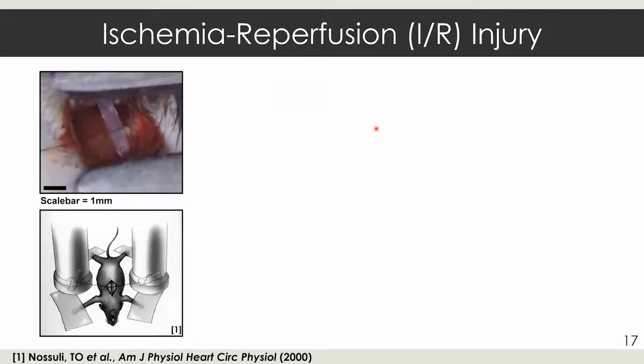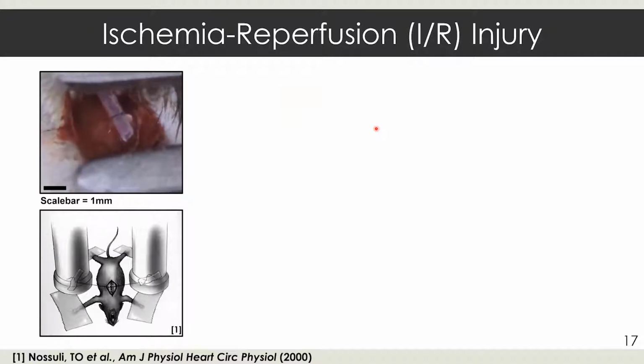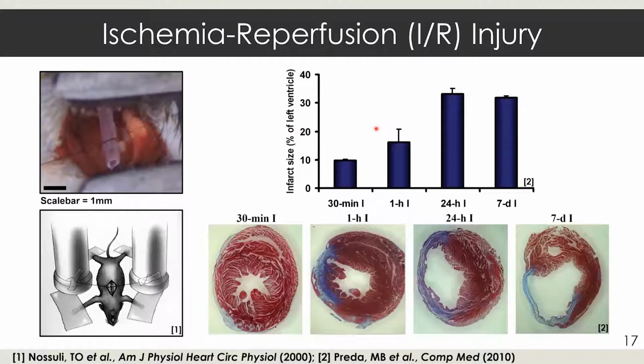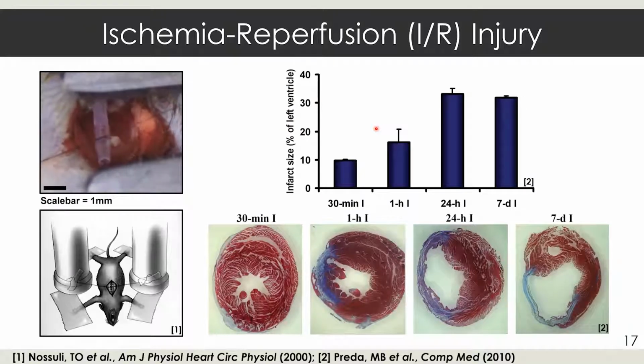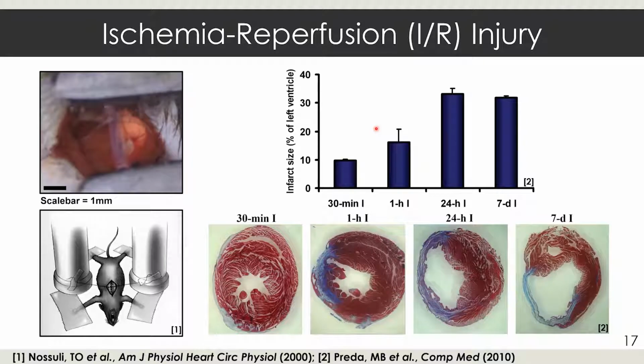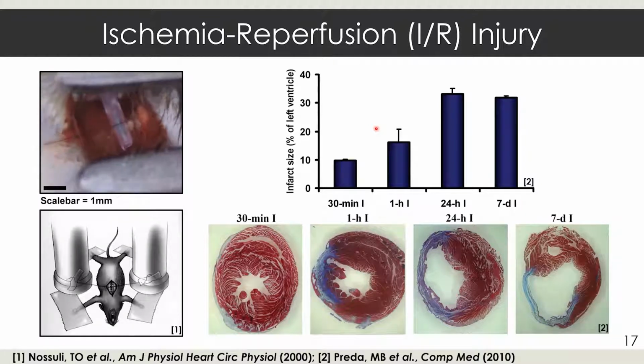Most people, when they have a heart attack, go to the ER and get the occluded vessels opened up. And we decided to do 30 minutes because we wanted to induce different severity of infarcts, and we decided to do the minimum amount to cause these non-transmural infarcts, to see if we can identify infarct sizes for cases where there's non-transmurality just based on their kinematics with our strain approach.